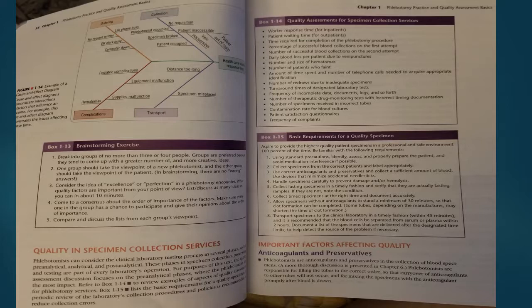Box 115, basic requirements for a quality specimen. Aspire to provide the highest quality patient specimens in a professional and safe environment 100% of the time. Be familiar with the following requirements. Number 1, use standard precautions. Identify, assess, and properly prepare the patient and avoid medication interference if possible. 2, collect specimens from the correct patients and label appropriately. 3, use correct anticoagulants and preservatives and collect a sufficient amount of blood with devices that minimize accidental needle sticks.